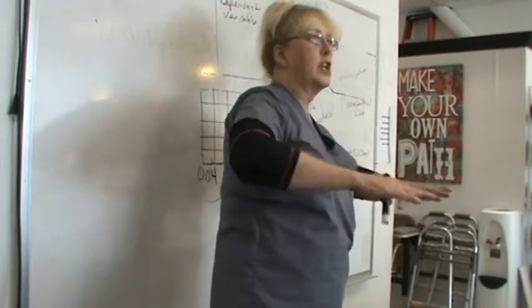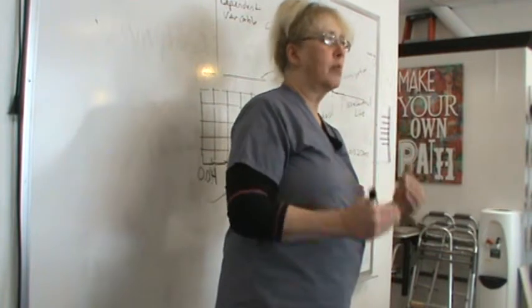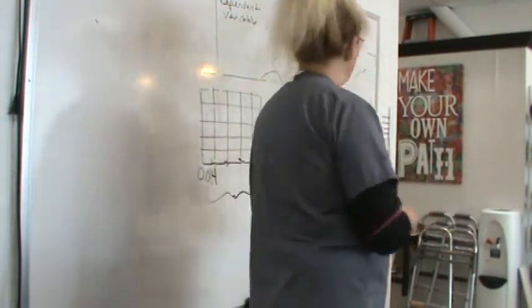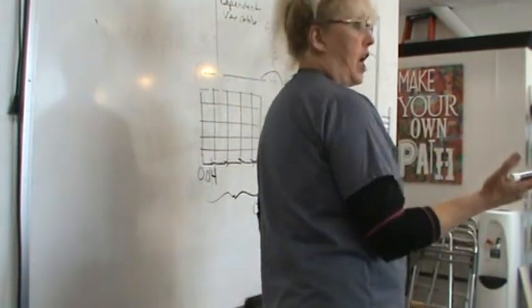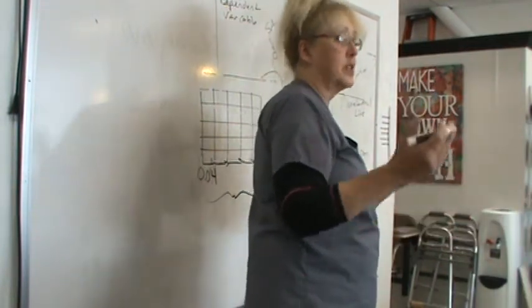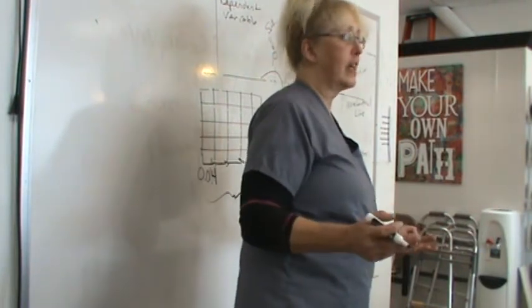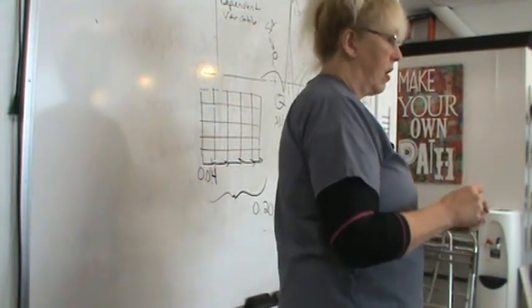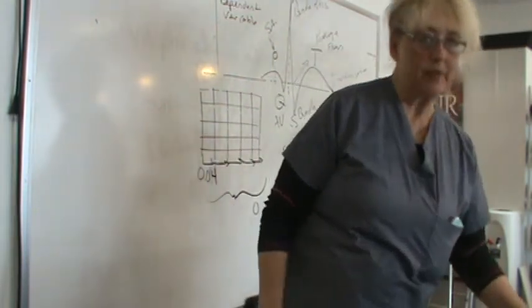We're beginning to look at a normal sinus rhythm then, right? A normal rhythm, as long as the heart rate is between 60 to 100. So if our heart rate is between 60 to 100, we're good. We've got a good solid normal sinus rhythm. Nothing's out of place. Everything measures correctly. There's a P wave for every QRS and a QRS for every P wave.